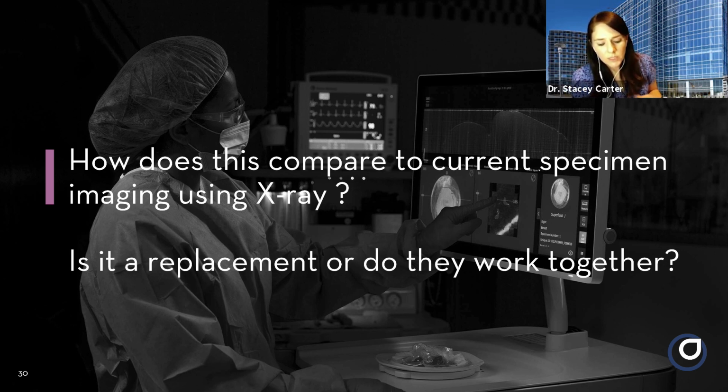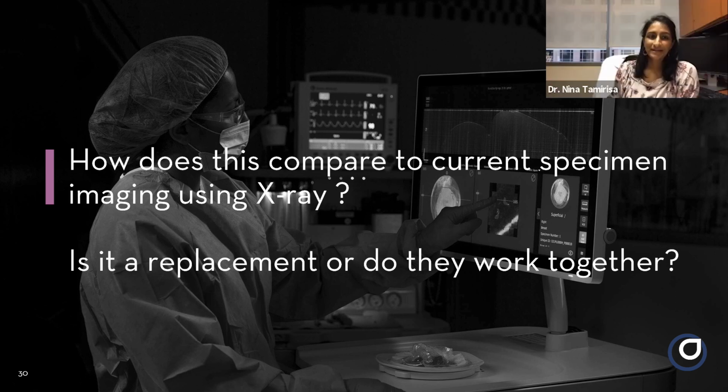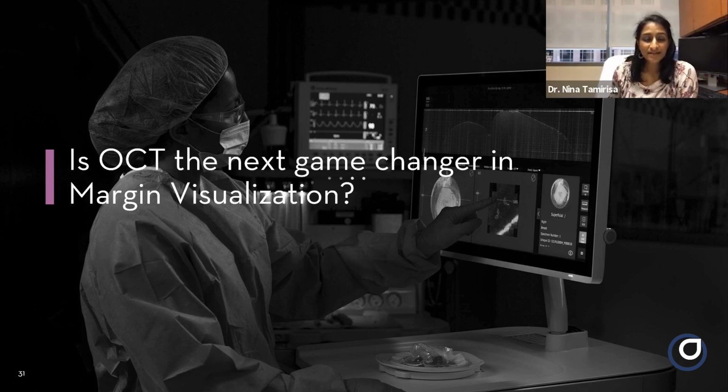But with the OCT image, we're really getting a high resolution view of the margins. So I think in reality, we would use specimen X-ray again for the verification of those objects that we're looking for, the clip, a wire or a seed, and make sure that they are removed. But really the value of OCT is looking at margin assessment. So yeah, I think it comes down to this final question: is OCT the next game changer in margin visualization?